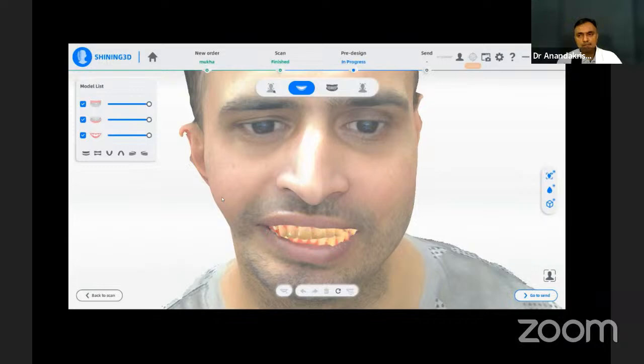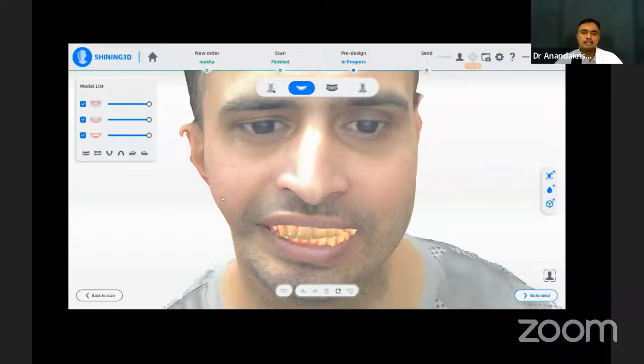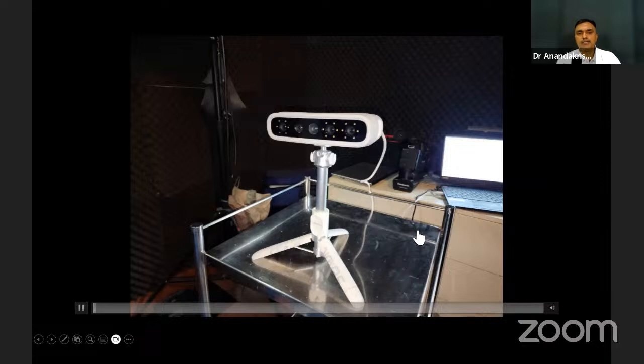Whether that is actually possible in the patient is something that you'll always have trouble estimating, because it'll look fantastic on the photograph, but when you try to translate that into meaningful patient work, sometimes you'll be left with a lot of discontentment, because it is not possible to get that particular outcome. But when you do facial scans and integration with an intraoral scanner, that will not happen. So that is the advantage of using a facial scanner.